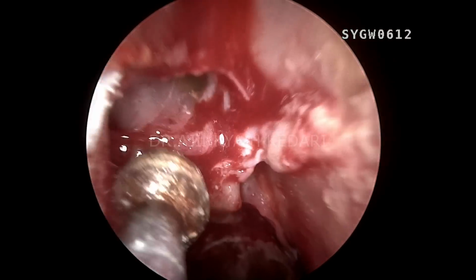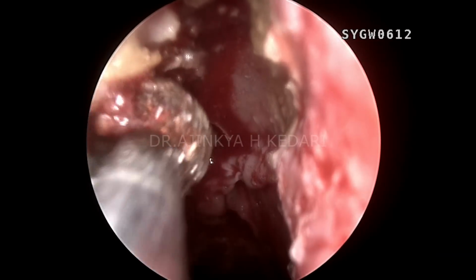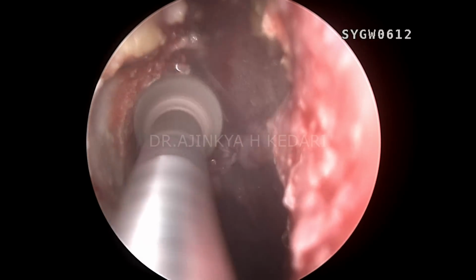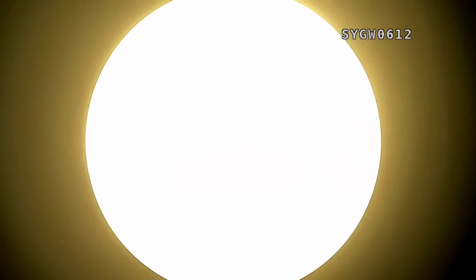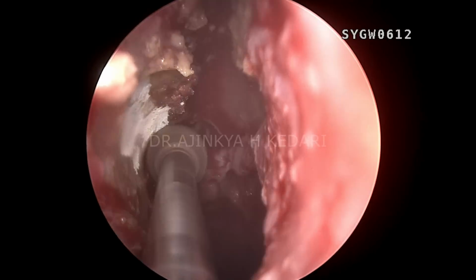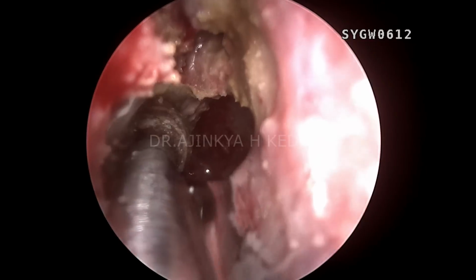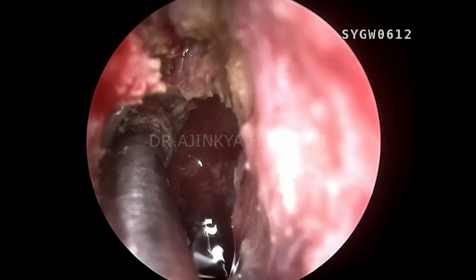Where I'm drilling right now is the frontal process of the maxilla, and it is way anterior, where you won't have the lamina papyracea. See, I'm drilling very superiorly, which is way above the lamina. So I'm drilling on the frontal process of the maxilla. You keep drilling it, you'll get a soft tissue, which is a skin. I'll show you. See, that is the skin. See, when I'm pressing against it, it's very soft.